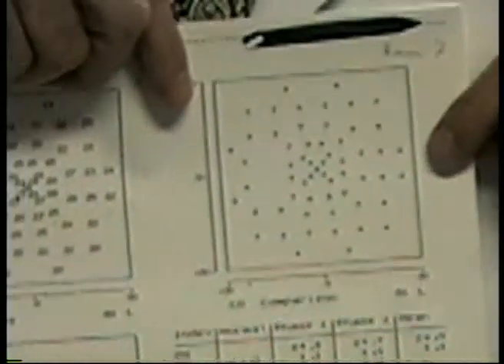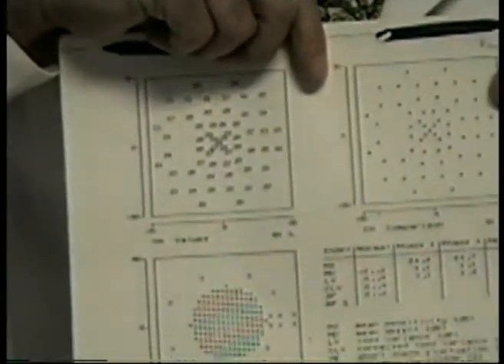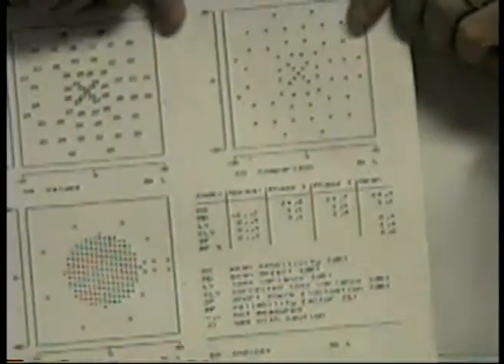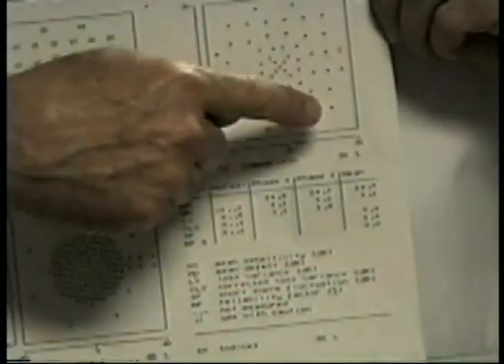Okay? So this is a normal field. Now, how does it know it's normal? Well, each machine has age-corrected normals. So it usually brackets people by 10-year age group. So people between 70 and 80 should see approximately like this. And what this printout over here does is it's comparing you to the normal person of your age, what you should see. And all these little pluses here means you pass the test on every one of them, which means this person was normal in every spot.